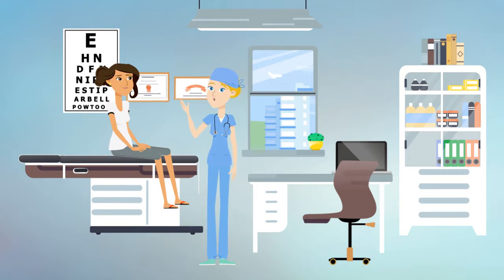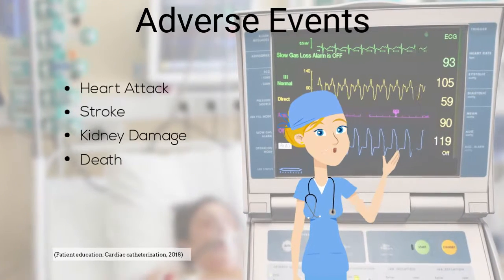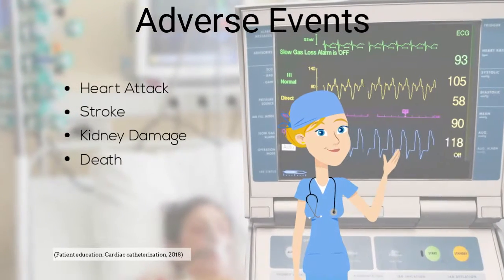Now that you understand why a cardiac catheterization is done, let's continue to explain how it is performed and get you ready for your procedure. Before your procedure, your doctor will review with you what to expect, as well as the risks and benefits of the procedure. Be sure to inform your doctor of all prescription and non-prescription medications that you are taking, including herbal supplements. Adverse events do occur, even with steps to prevent them.